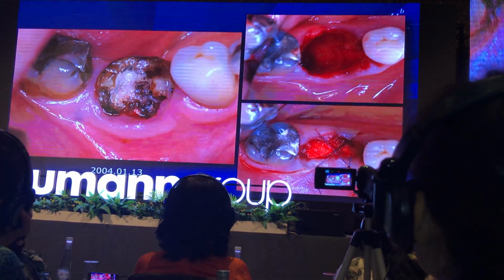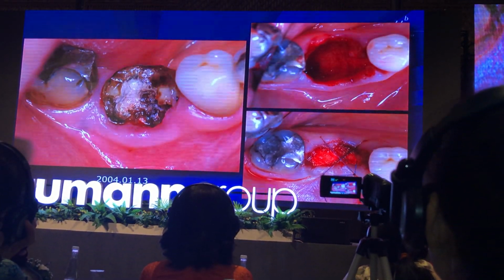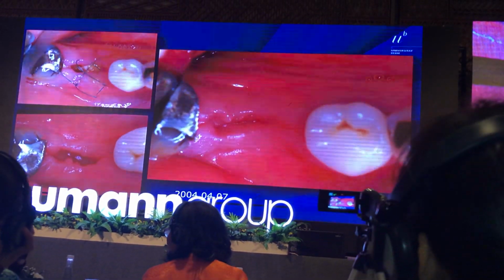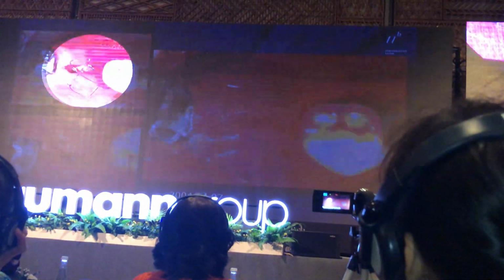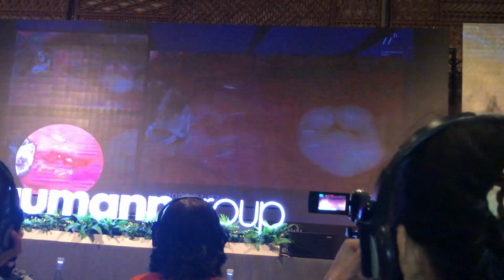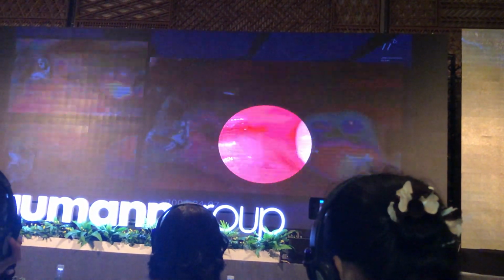So I took the tooth off, put a collagen plug in, and let it heal. And you see, the healing was not uneventful, because we lost a little bit of tissue here, and it took time to fill up. So this is 4 months later, it looks like this.